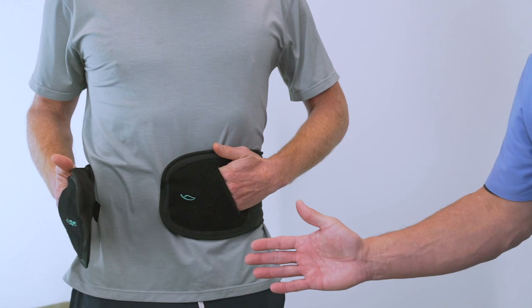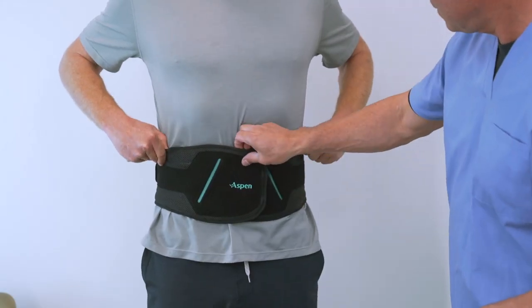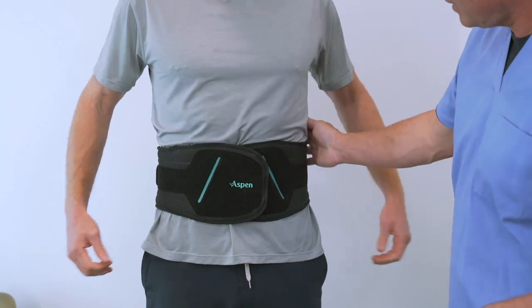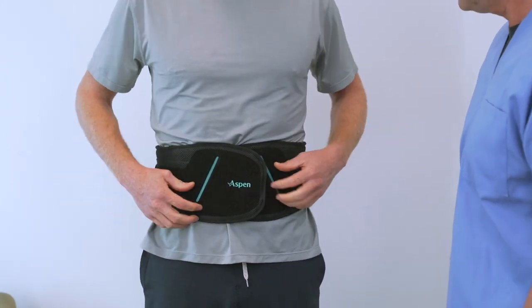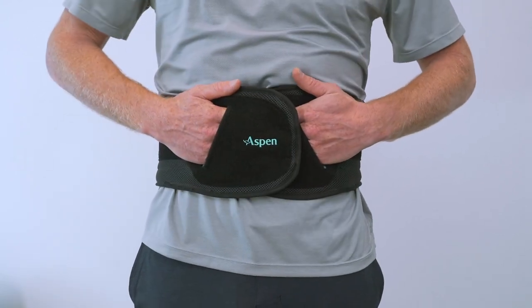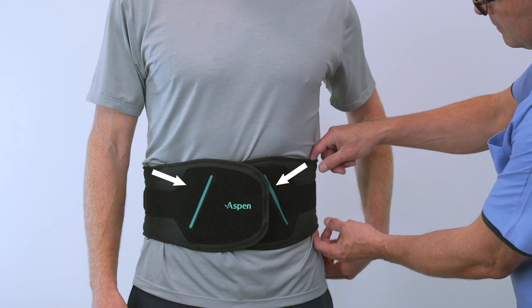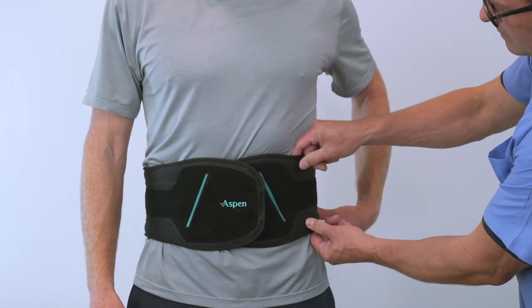Wrap the right side tightly around the body and press down firmly. Be sure both the bottom and the top of the belt are snug before tightening with pull tabs. If not, peel back and tighten the ends of the belt again. The belt might need to be angled to achieve proper fit.